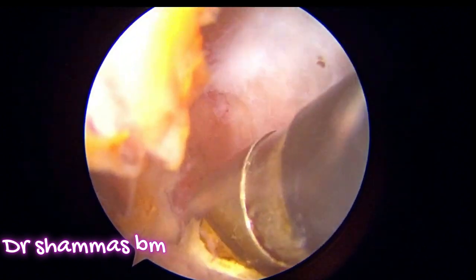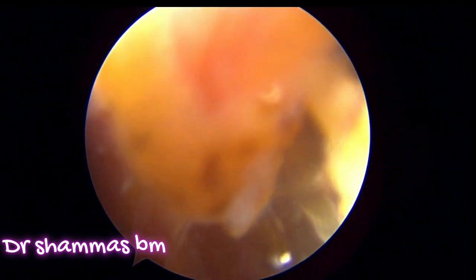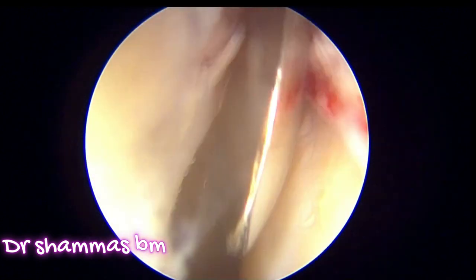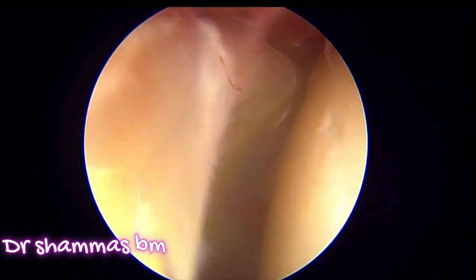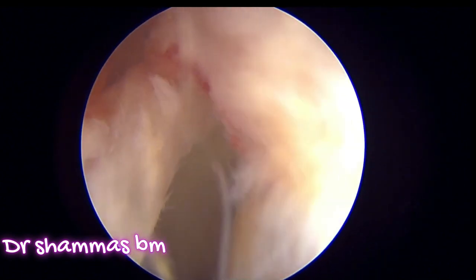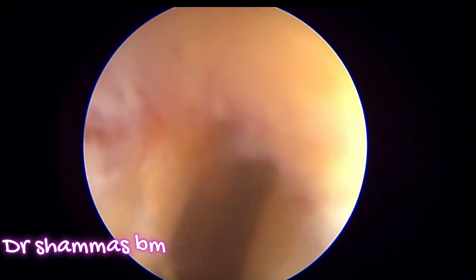Here I am using an RF to clear the soft tissues outside the joint close to the labrum. The next step is clearing of the soft tissues and then elevating the labrum from the pincer lesion. The labrum is attached to the pincer lesion, so to clear the pincer you have to initially elevate the labrum from it. You can use either the knife used earlier or a blunt elevator and slowly do it. Be careful — the labrum is a very important structure; you should not injure it or cut it into two pieces.